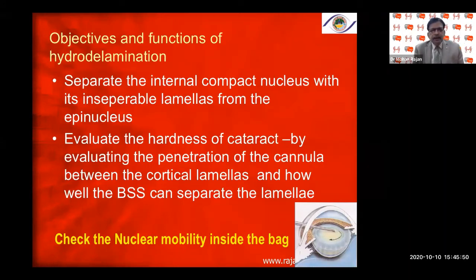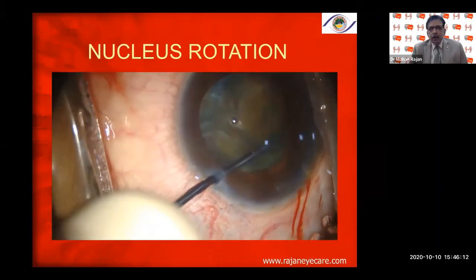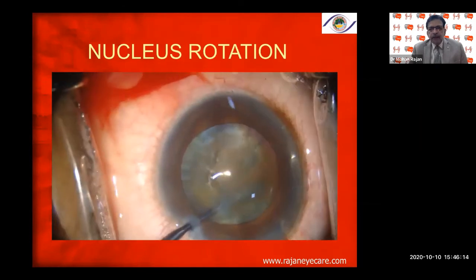Hydrodelineation separates the internal compact nucleus with its inseparable lamellae from the epinucleus, evaluates the hardness of the cataract by the penetration of the cannula between the cortical lamellae, and checks how well BSS can separate the lamellae. It also checks nuclear mobility inside the bag. After hydrodissection in a fairly dense cataract, perform nuclear rotation — the nucleus must rotate freely. If it doesn't, do not try to rotate it forcibly, as you can damage the zonules and posterior capsule.